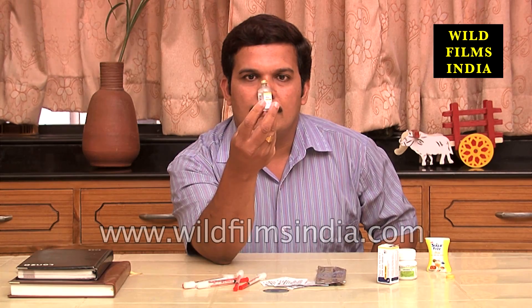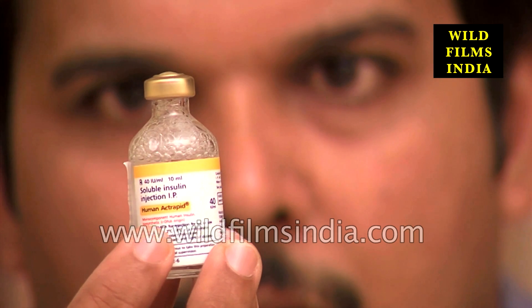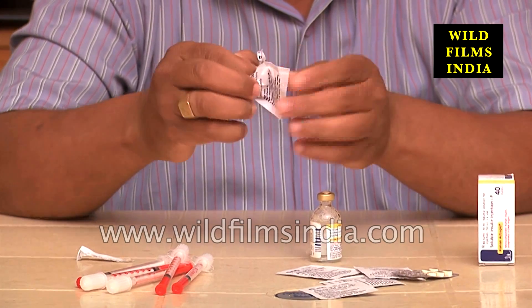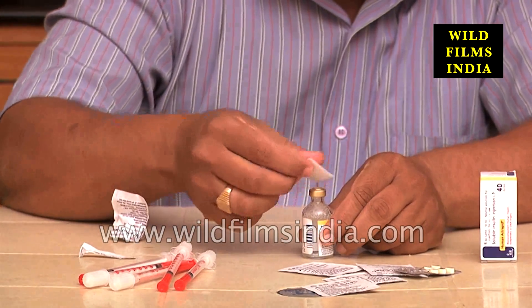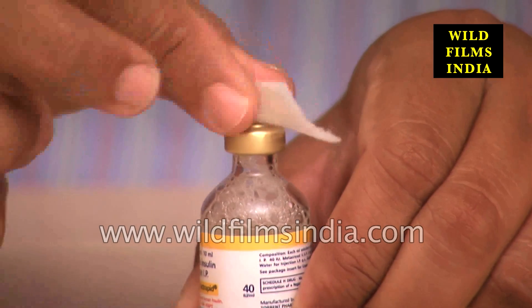If the vial has expired or the insulin appearance looks different from normal, do not use it. Obtain a new vial as soon as possible. Clean the rubber stopper on top of the insulin vial using an alcohol pad. You should do this each time you use the insulin.